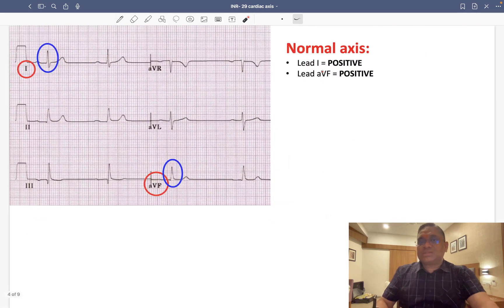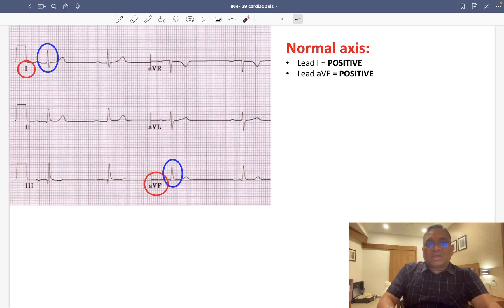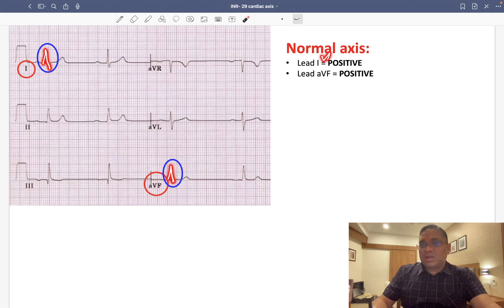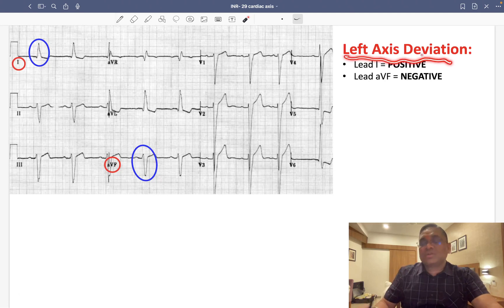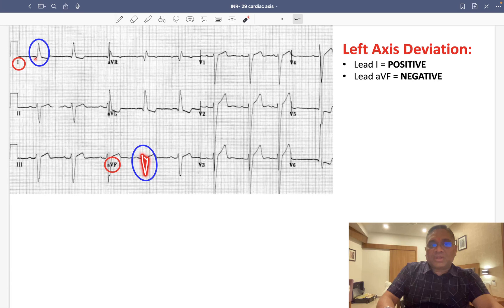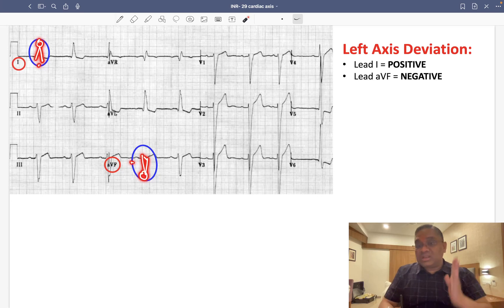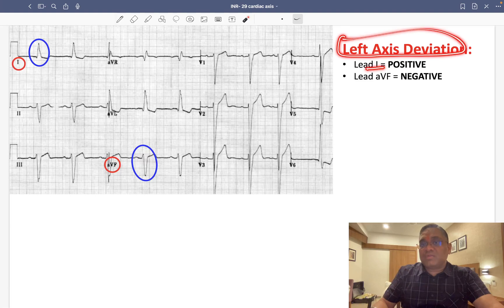Let us look at some ECG examples. For normal axis: target lead 1 and AVF — both QRS complexes show positive deflection, confirming normal axis. For left axis deviation: in lead 1, QRS deflection is positive; in AVF, QRS deflection is negative — so they are leaving each other. This confirms left axis deviation.